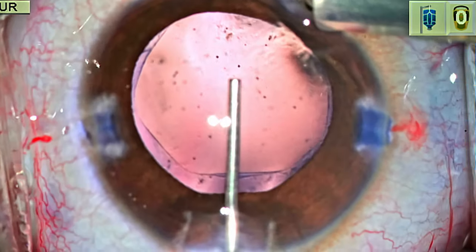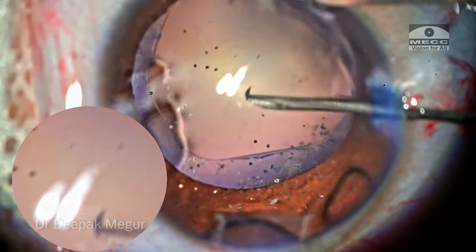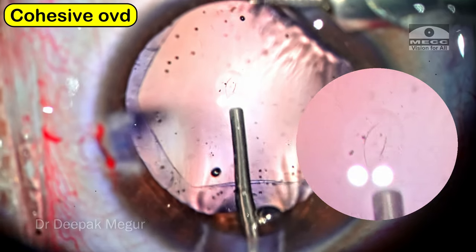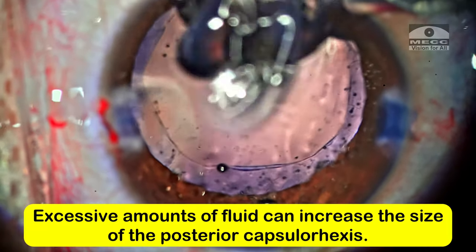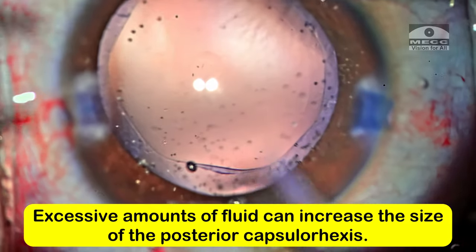Now is the time to perform the posterior capsule rhexis. Again, I'm going to puncture the capsule using a bent 26-gauge needle. I can see the split in the posterior capsule. I'm going to use cohesive OVD to place it under this opening so that it pushes back the anterior hyaloid a little bit. Mind you, we cannot overdo this step because excessive OVD injection can extend the posterior capsule tear — at this stage it is still not circular and has a propensity to extend in either direction.